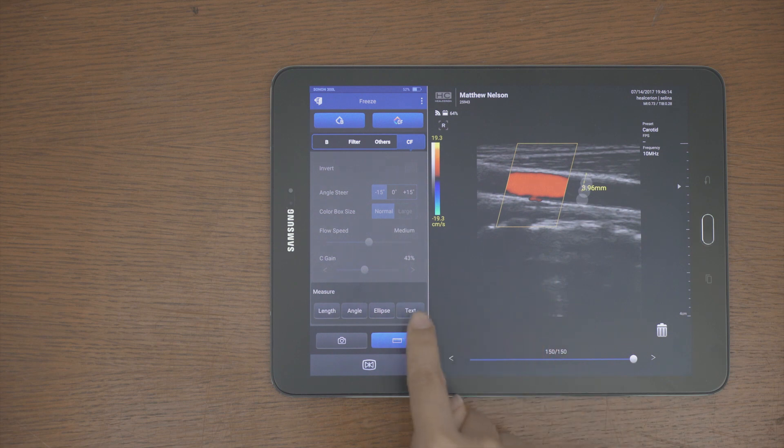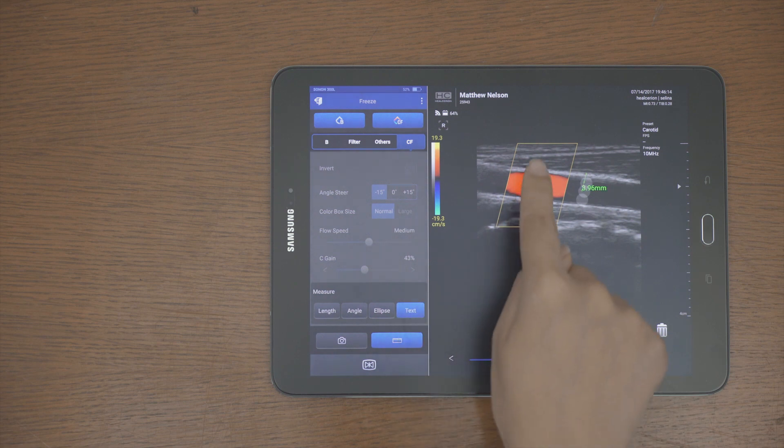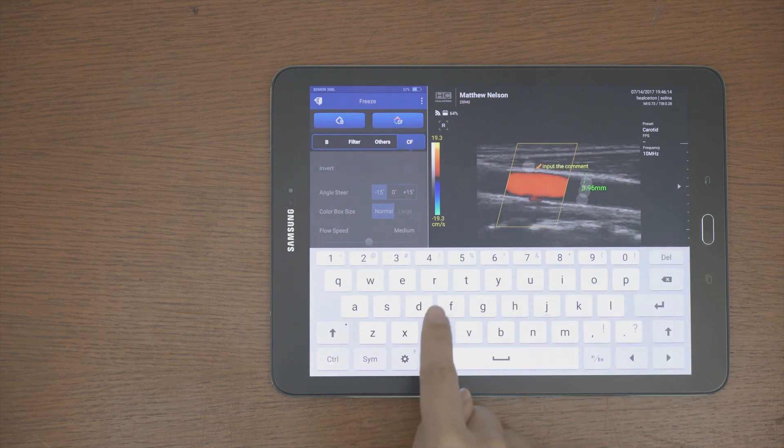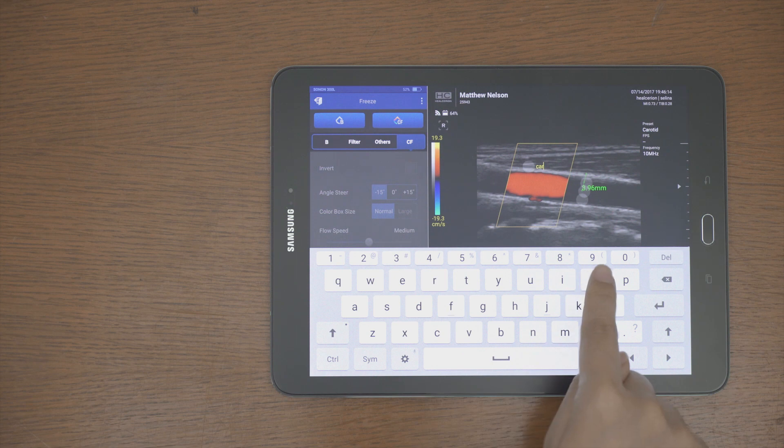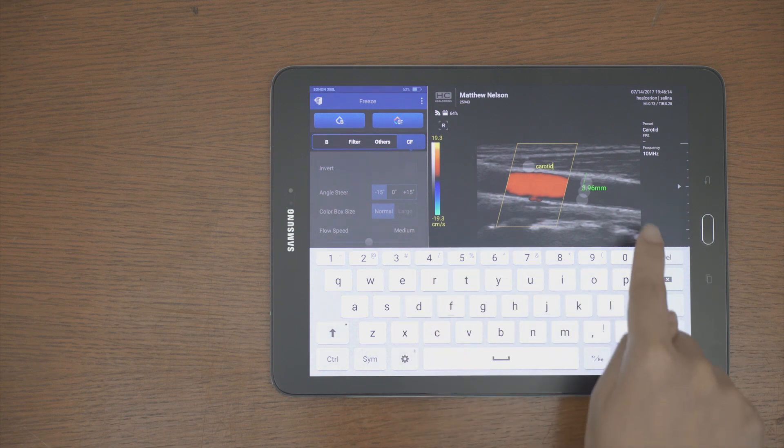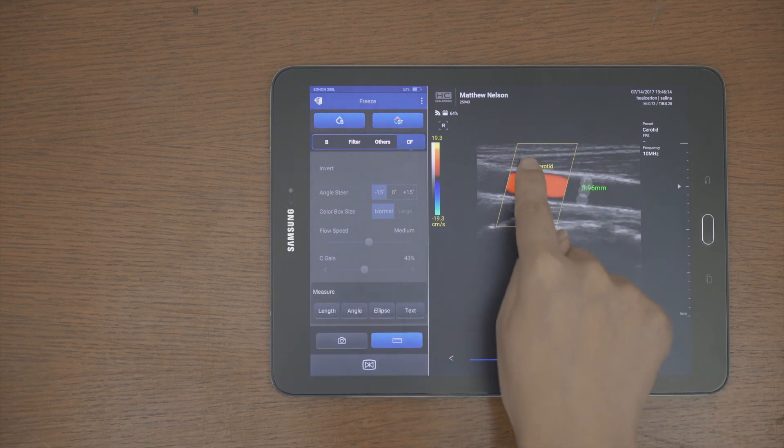Measurement functions as length, ellipse, and text can be easily used. For Convex Pro, fetal biometry is added to calculate BPD-EFW.